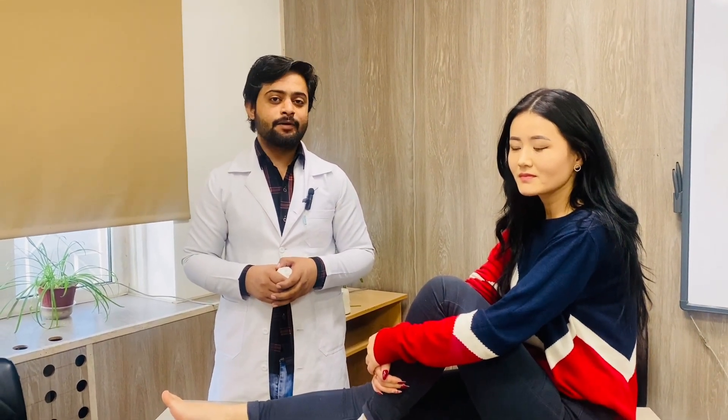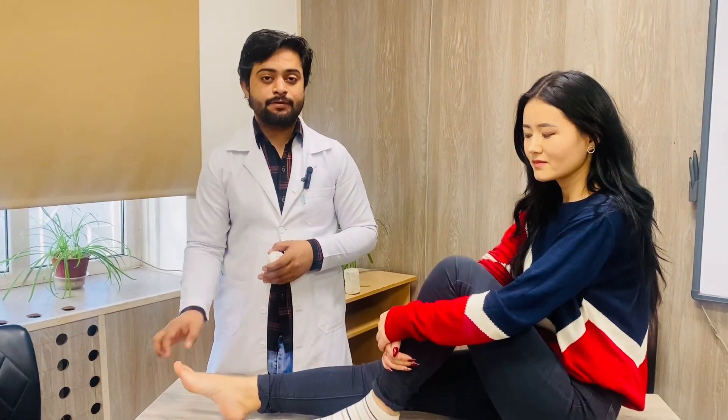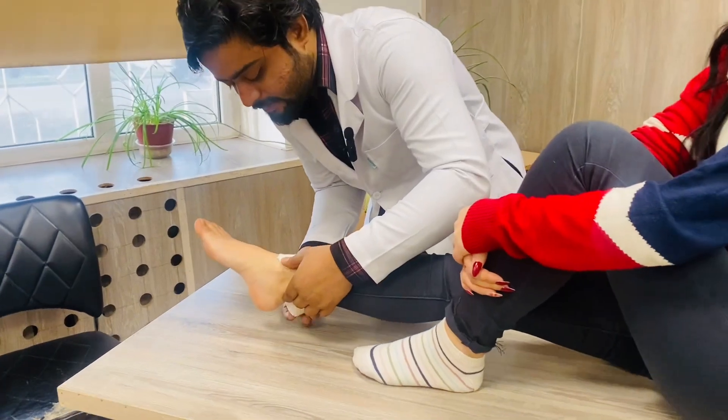Welcome back to doctrinal lectures. In this video, we will talk about the spica bandage towards the thumb of the foot. Let's start — first of all, you will make two circulations here like this.